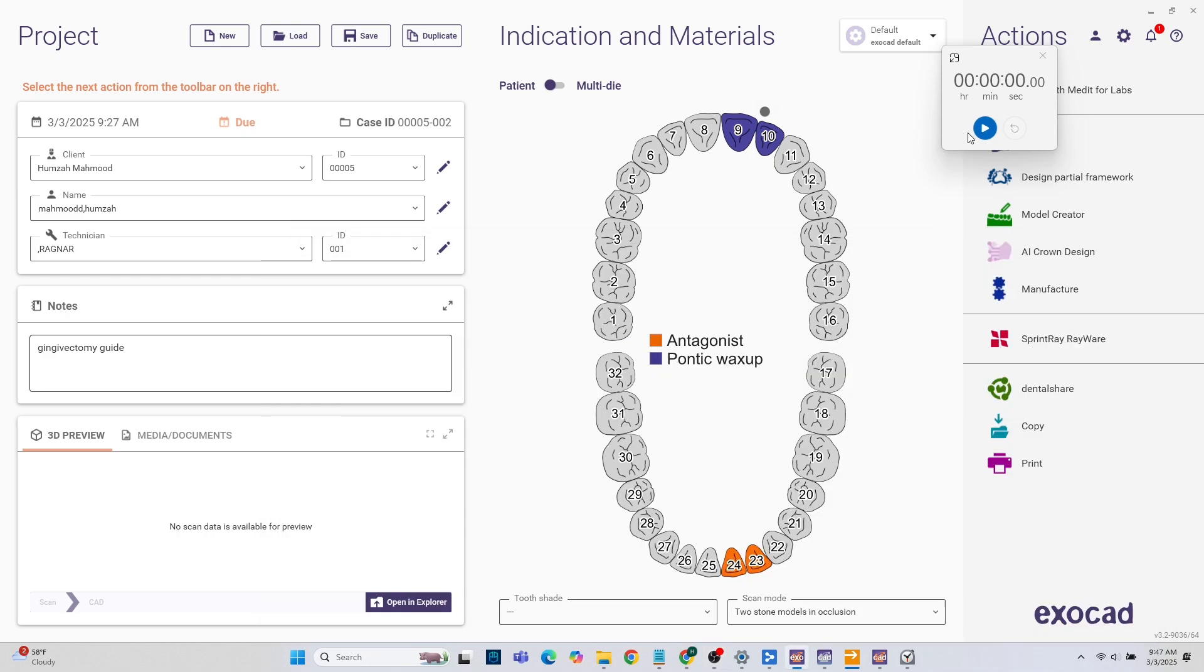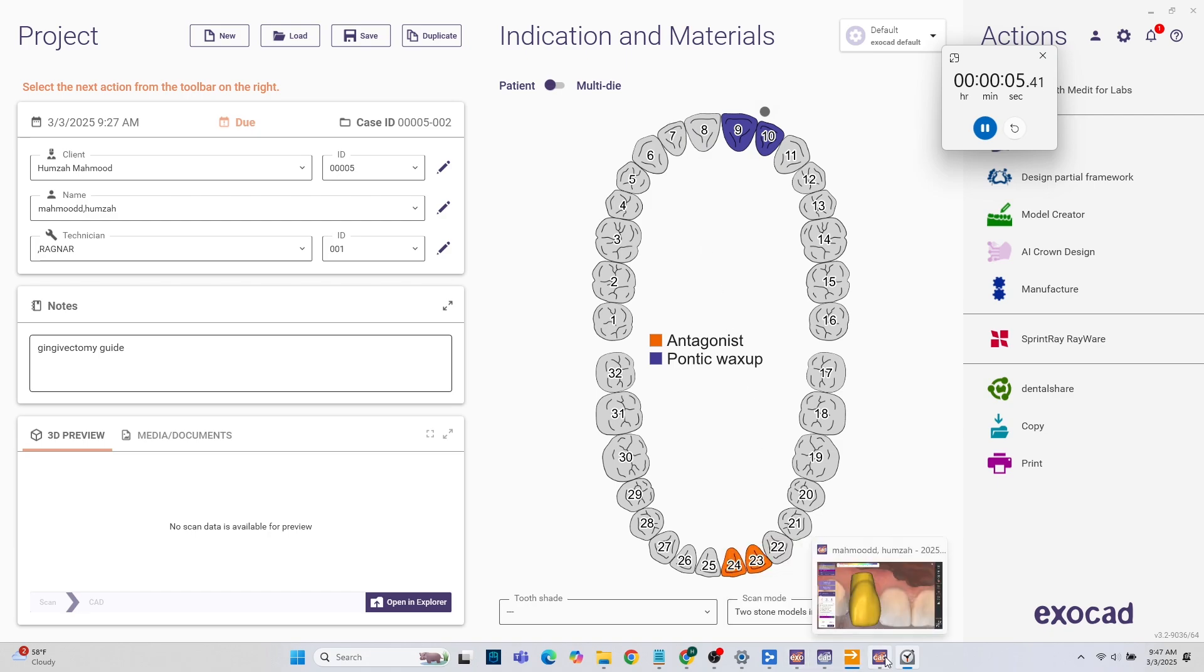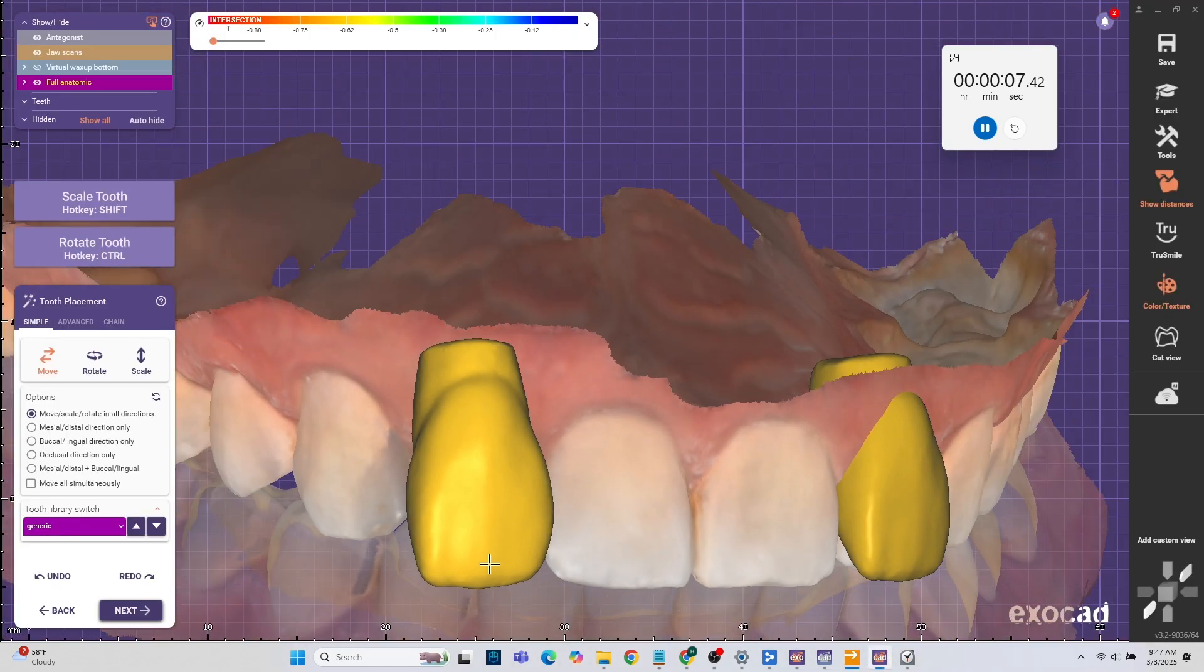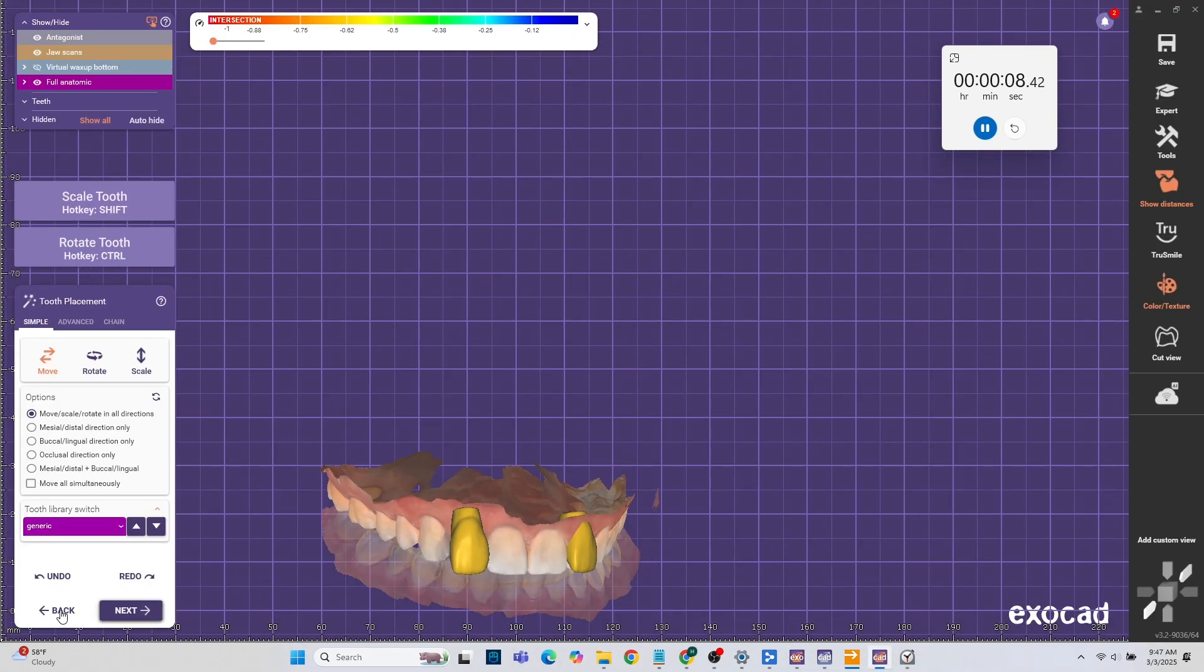First we're going to start with setting up the case. We used Pontic Wax Up and Yes Design Digitally. We already started but then I decided hey this is a cool video to show you guys.